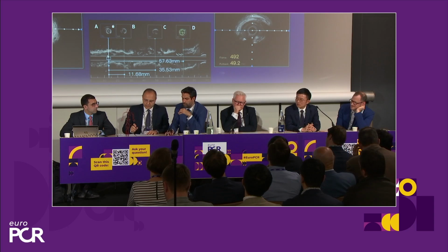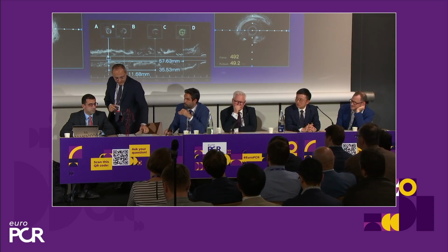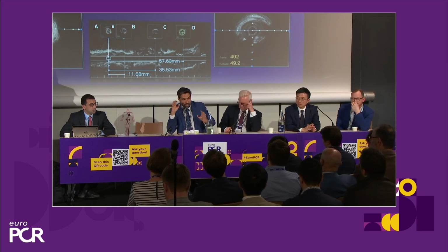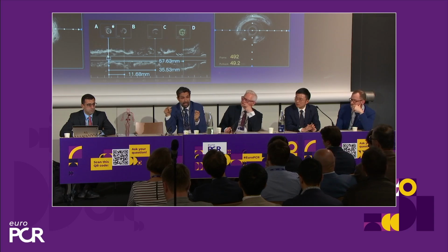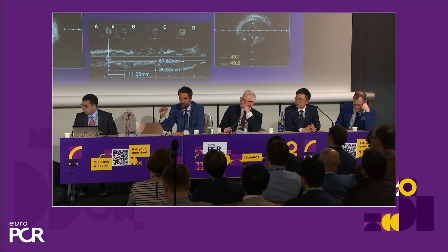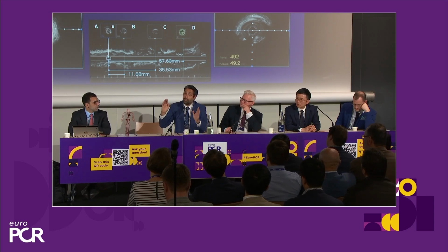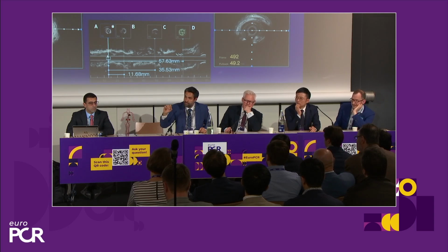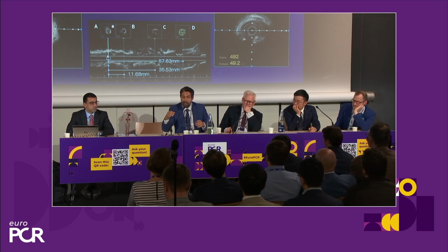I'll take this one, and I think the question of the colleague and the case in particular is quite useful to explain this concept. When we think about focal and diffuse disease, sometimes the anatomy in terms of plaque is different from the physiology. What matters for the restoration of the flow is the physiology. So basically, if you have a step up, you can fix it, period. Now, that doesn't tell you where you have to land. That's a different story. So this is the typical case of functional focal disease and anatomical diffuse disease. So there is anatomical disease that does not produce pressure losses. It's just the plaque.